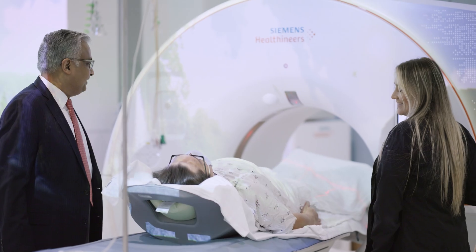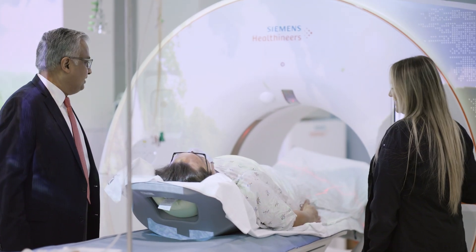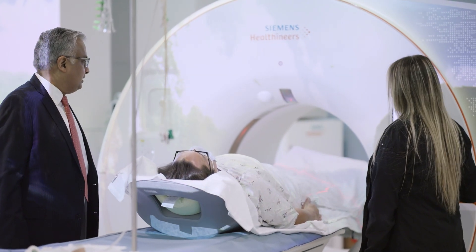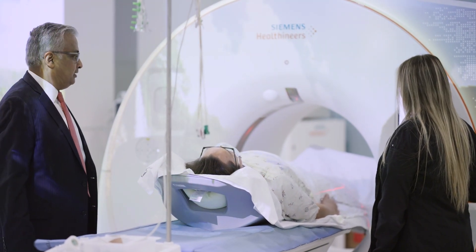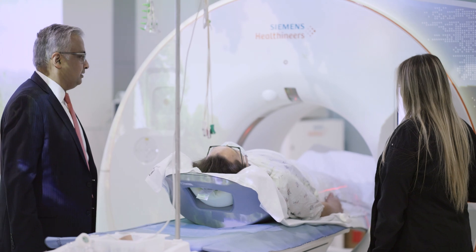CT-FFR is an advanced technique of analyzing CT images. We perform a very specialized approach to take multiple x-rays using the CT scanner — it's a non-invasive technique. We do inject IV contrast dye and we get very high spatial, high quality images.